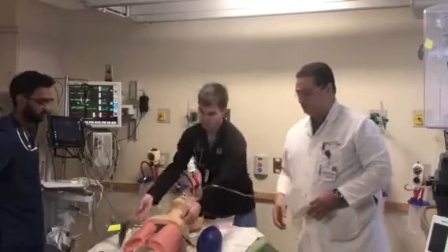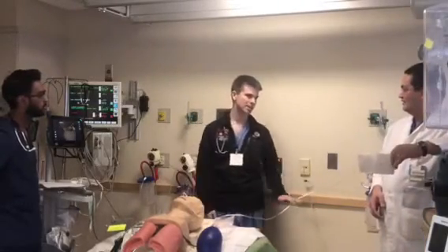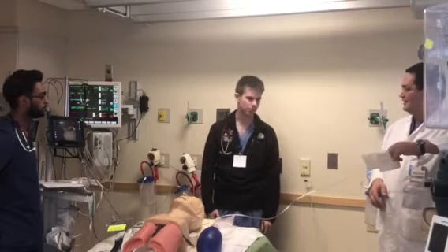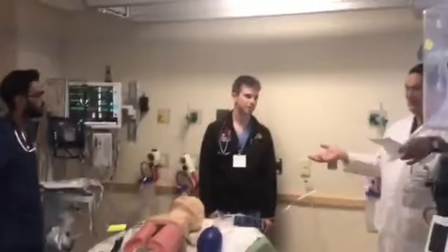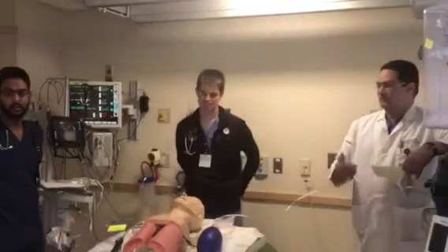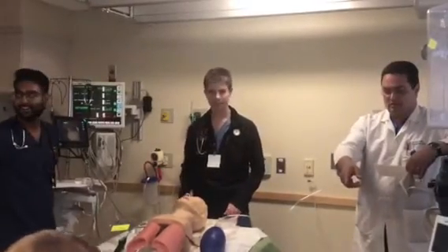And we're gonna do what? And he's still the same guy, like difficult airway. Yeah. Difficult airway, everything. I mean, do we then proceed with the cricothyrotomy? Yes, cricothyrotomy. So give me the needle cric, please. I lost the nurse. Only the cric. No, the needle cric is the lowest part.